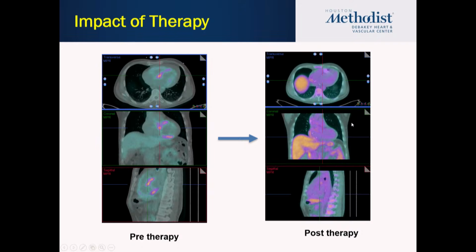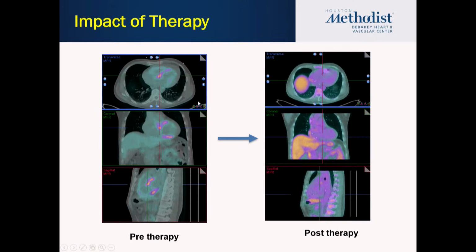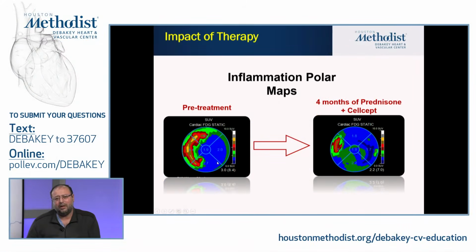Also, we're investigating how to assess response, because we don't always have complete recovery where it's completely gone, from normal to just a blood pool, but rather sometimes we have some reduction in inflammation, and which parameters you take for that. So this is, for example, a patient who had multiple MRIs with multiple PET scans with us. You can see initially the area of inflammation is this green, red, and the different areas, and these are color coded by the amount of FDG that's uptaken, and her SUV max is 8.4.